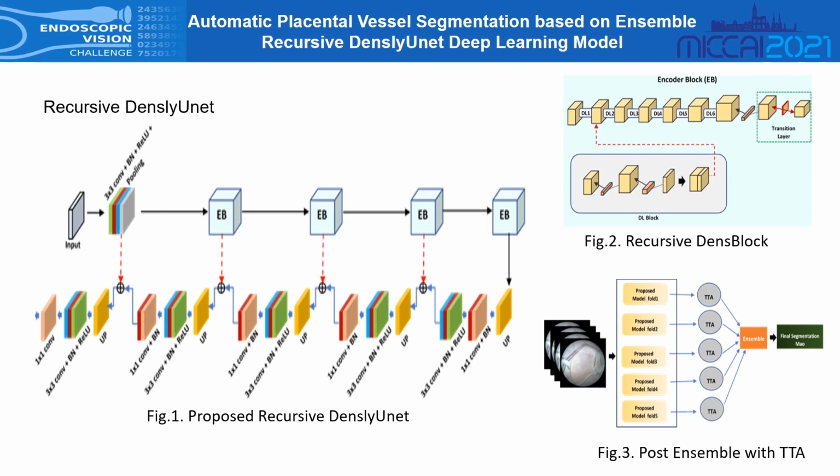capability. The efficient and lightweight 2D convolutional layer block with 2D upsampling layer has been built on the decoder side of the proposed approach. The proposed dense block uses successive numbers of feature maps in each encoder layer. We have trained our proposed model using 5 k-fold cross-validation and ensemble the output of each trained model using max majority voting ensemble method to combine or aggregate the final prediction segmentation map.